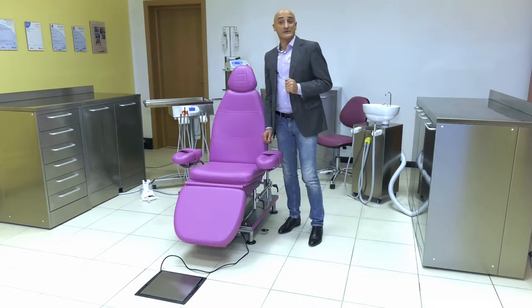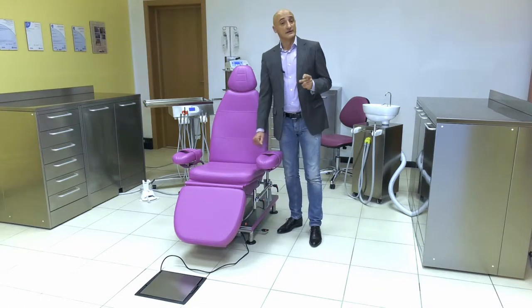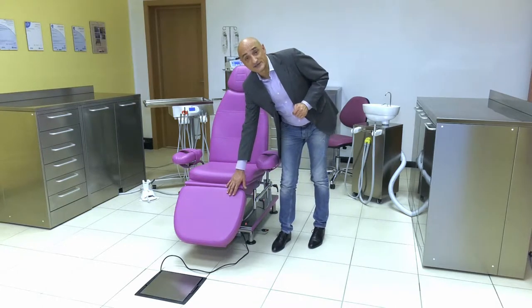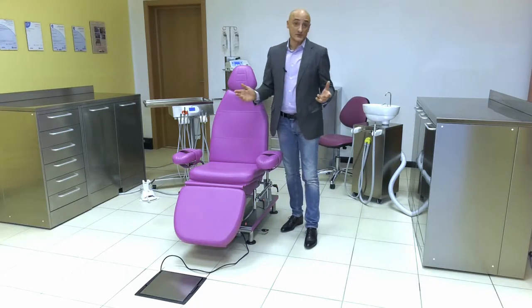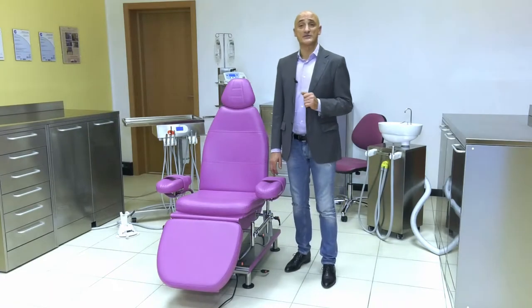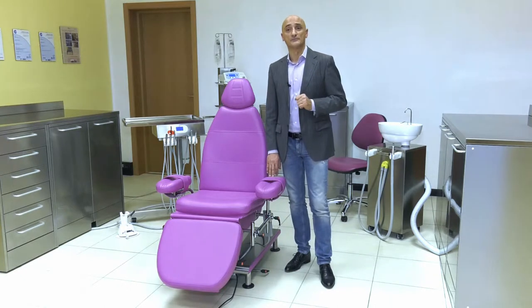Two for the classic movements of lifting and lowering of the back and seat, and two for lifting and lowering of the footrest and inclination of the Trendelenburg or anti-shock position. This solution will allow you to position the patient in the best position for your work setting.